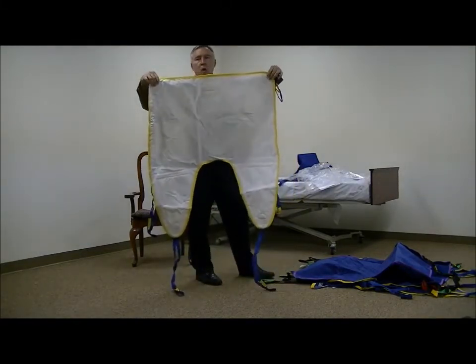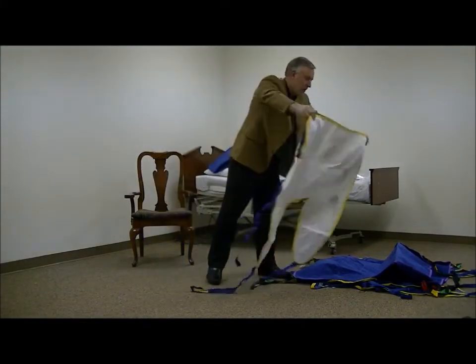Now they're available with the universal support or with the head support. We'll be showing you some other versions of that here in a minute.